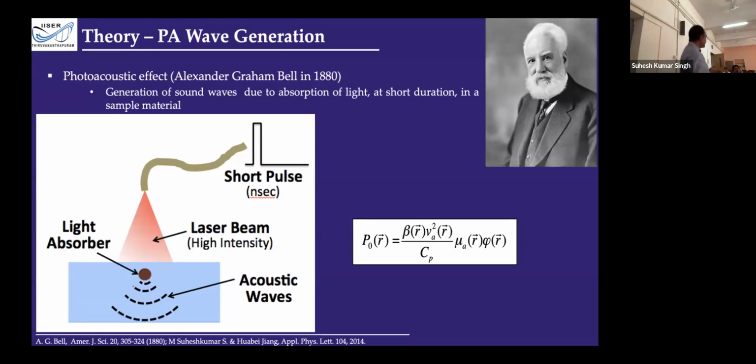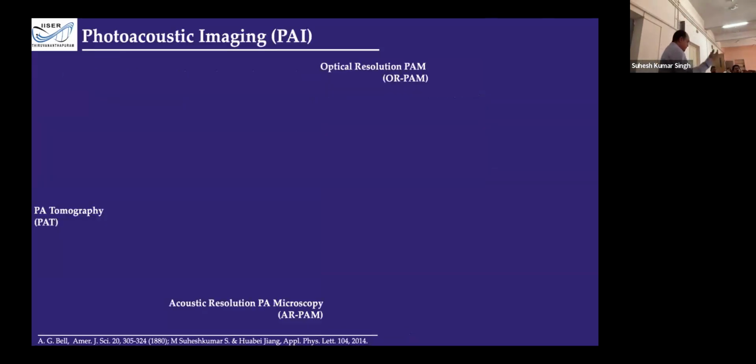Next, with these physical parameters, is there any implication for the clinical evidence? This is one. Okay, so mechanical properties we can recover, and that has a huge application for clinical studies and for diagnosis. As we are conveyed by clinicians, a lot of diseases remain silent out of this recovery of elastic properties. In other words, if we can recover the elastic property distributions in the body non-invasively and non-destructively, we can unlock a lot of diagnosis for diseases. Okay. So now I will move to the development of the imaging.